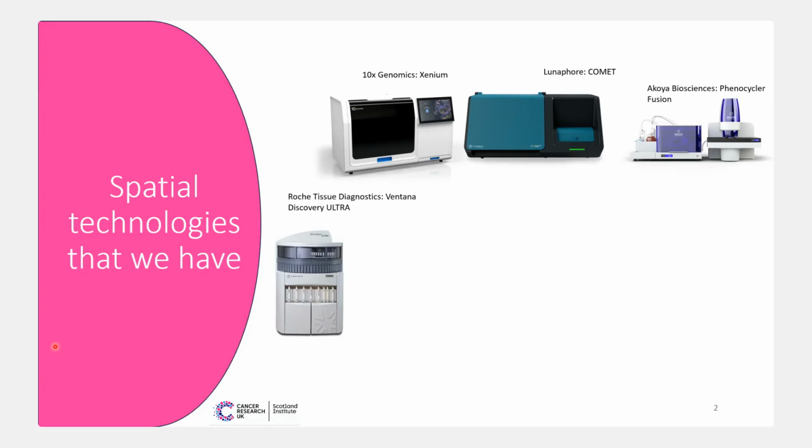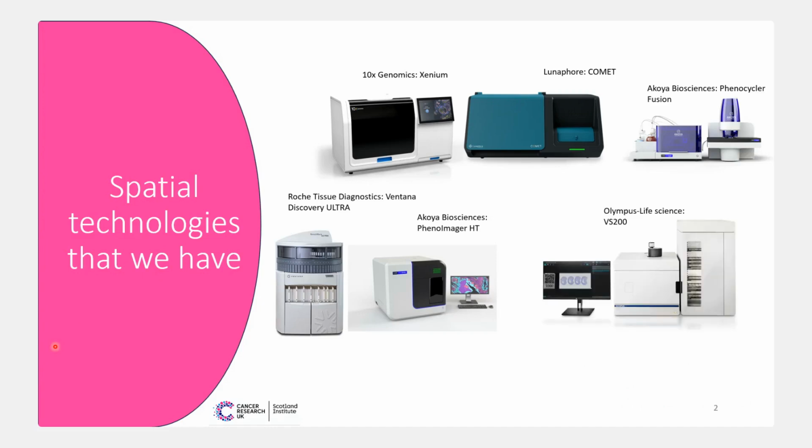We have the Roche Ventana Discovery Ultra, which is our lower plex instrument, but it's our more high throughput. And this can do up to 8 proteins plus DAPI. And we scan all of our lower plex assays on the Akoya PhenoImager. And our newest toy in the lab is the Olympus VS200. And today I'm mostly going to be speaking about how we use Visiopharm to analyse more of our lower plex assays.